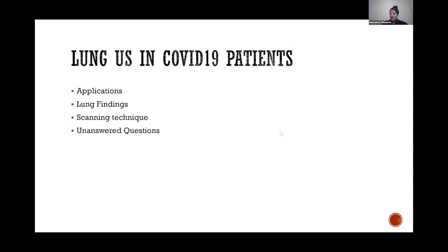I agree it's a good idea to echo all COVID patients if you are able to perform echo knowledgeably, and I think that's where the biggest limitation is. If you can perform focused echo, I would highly suggest that those of you with that skill should do that with all of your COVID patients. I think it's incredibly important.